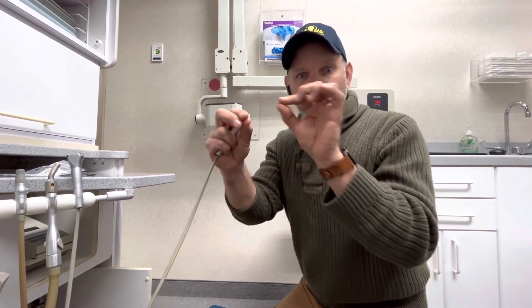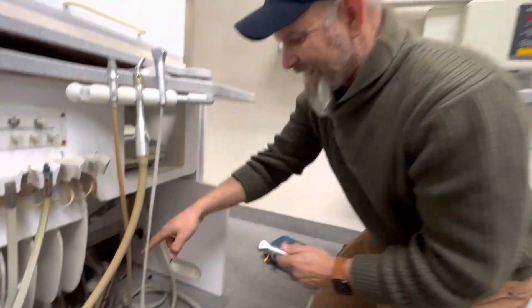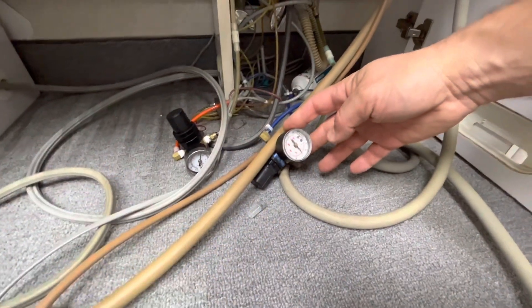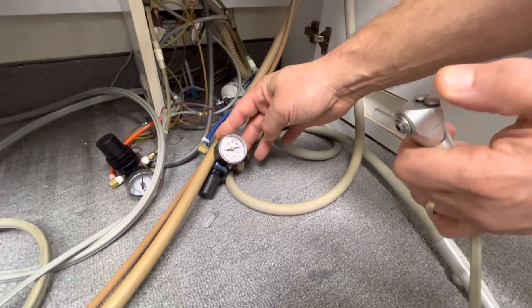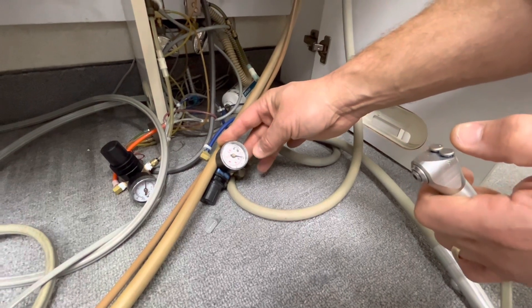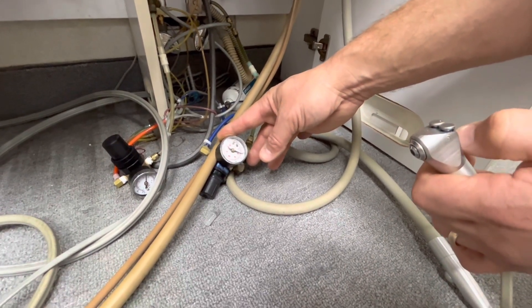The water will re-equalize. We've got a gauge here that gives us an indication of what the water pressure is for the water syringe. When I push the button, you can watch the gauge — it actually goes down. That's a really good example of how water pressure will equalize across a clog.